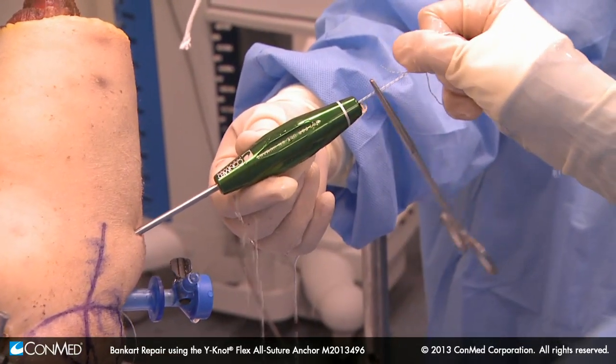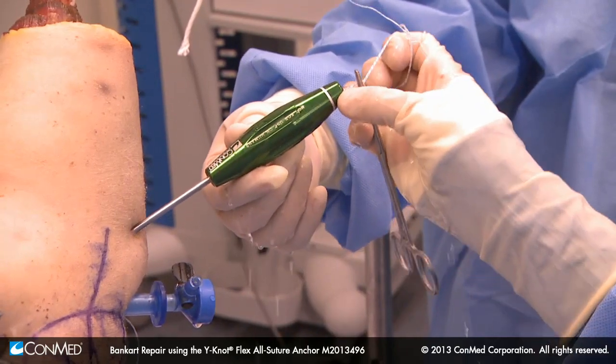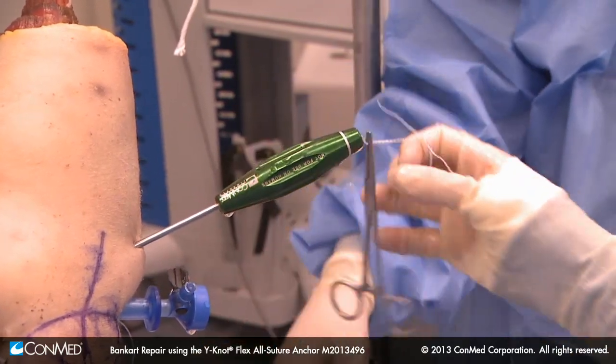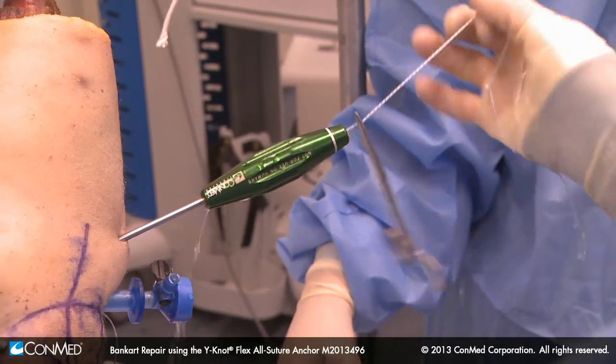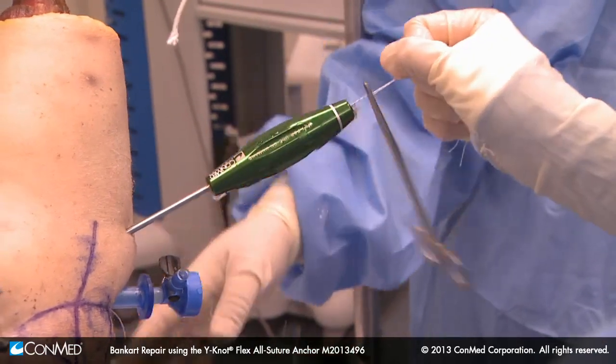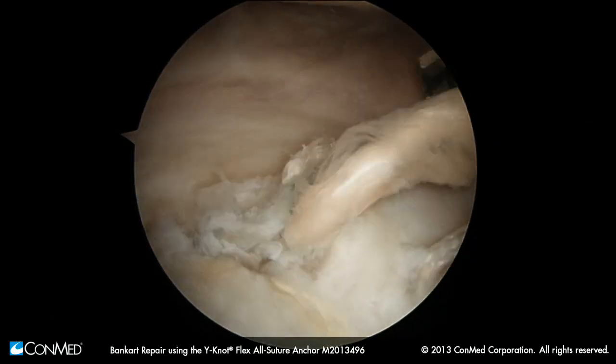This way I'll know just how far I need to pull before this thing sets. In case I've lost track, I ask: can I stop pulling now or not? As you get more comfortable with these, you'll recognize you want probably about a finger breadth. When it locks down at that point, you can say I'm happy with my fixation.